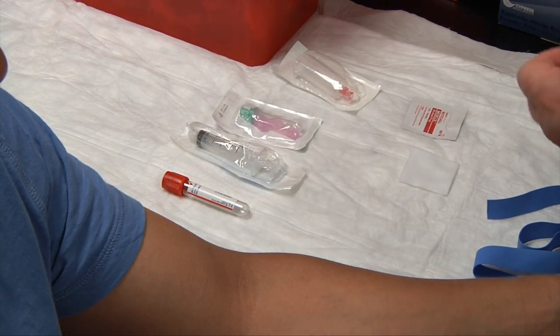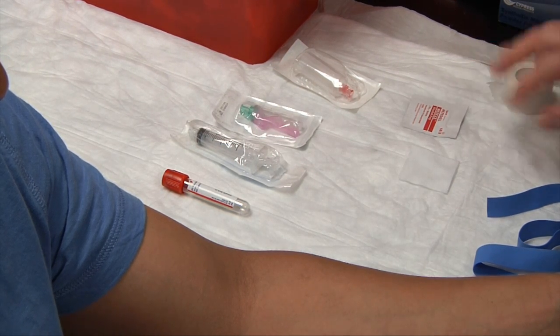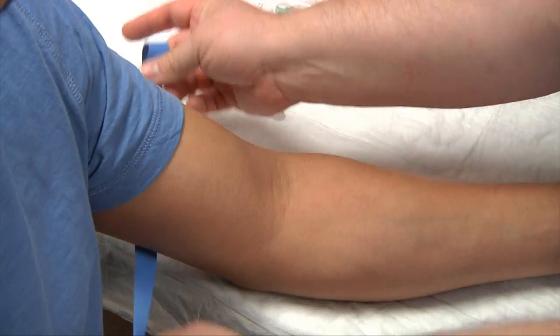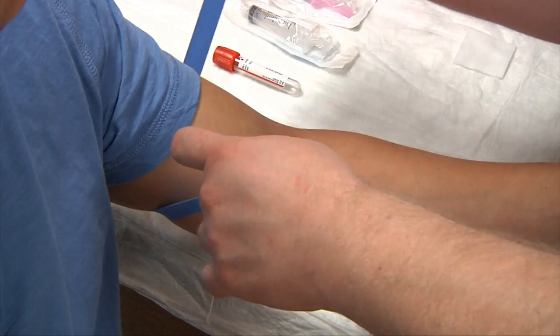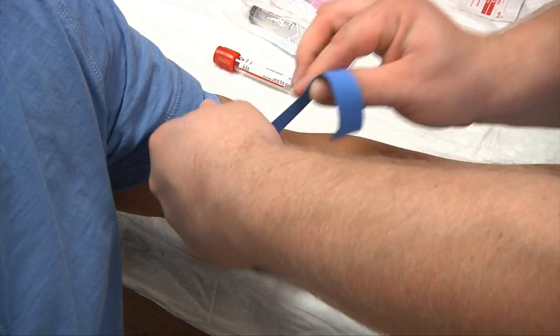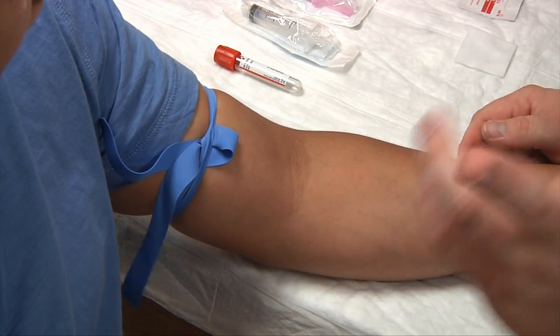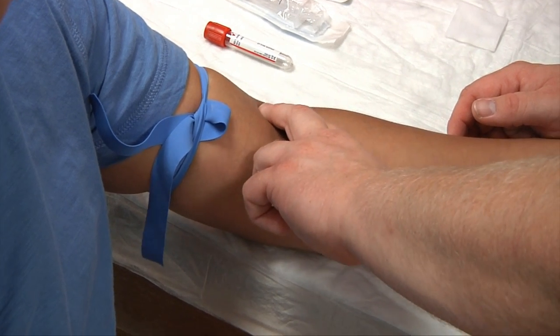Let's go ahead and tear off a piece of tape and put that on the corner of the table. We'll need our tourniquet — go ahead and apply this now. I've already asked my patient for consent and explained the procedure, and I've previously washed my hands.